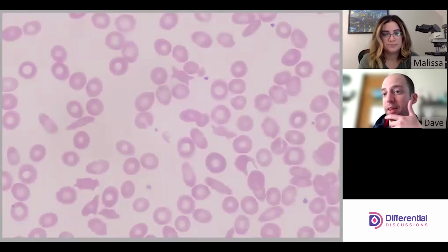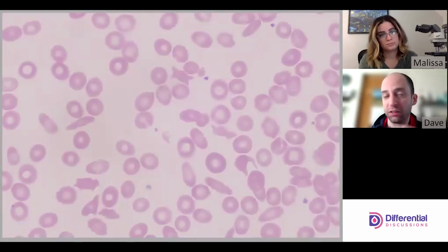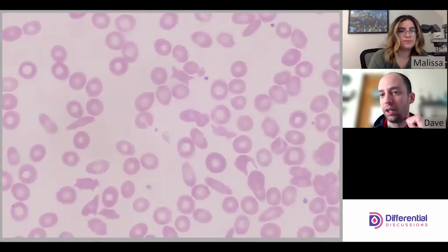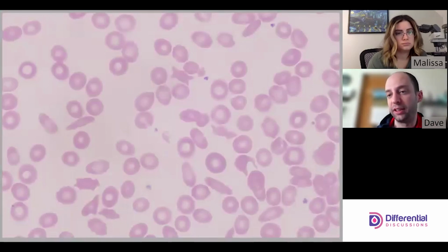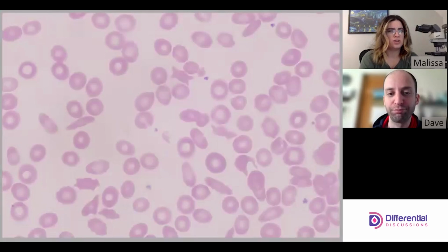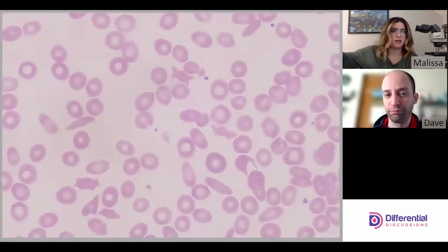And so this is another point, right? We saw a field overwhelming with acanthocytes, and yet we would not call it. Yeah. Acanthocytes especially can be localized artifacts on a smear, so be very sensitive to the area. And this goes back to drilling in the basics: the morphology that you inevitably call should be representative of the greater slide that you see, and not just isolated to a field. Yep, absolutely. That's why I was saying I'd want to look some more to see if there are any more acanthocytes, but if they're all bunched in that one section of the slide, then I wouldn't call it.